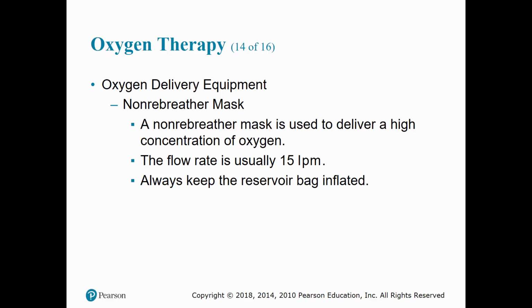A non-rebreather mask is a device that has an oxygen reservoir bag attached to the mask with a one-way valve between them that prevents the patient's exhaled air from mixing with the oxygen in the reservoir. The mask also has rubber washers that cover the exhalation ports. This allows air to escape on exhalation, but restricts air from flowing in the exhalation ports during inhalation. With each inhalation, the patient draws in the contents of the reservoir bag, which is 100% oxygen. Because some ambient air is inhaled from around the edges of the mask, the oxygen concentration delivered is usually around 90%.